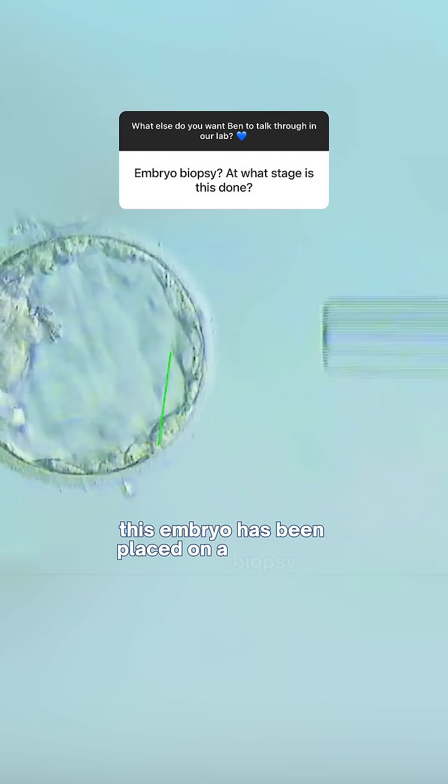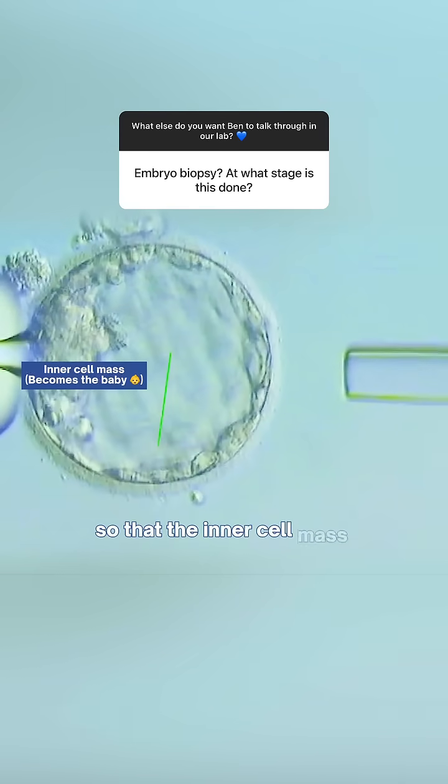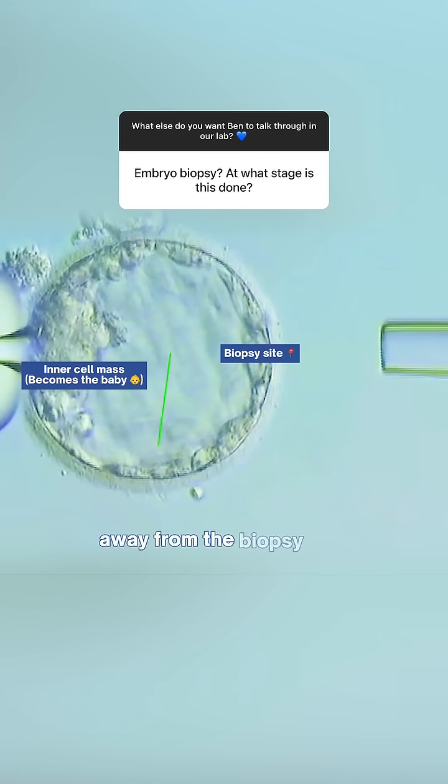As you can see, this embryo has been placed on a biopsy rig. It will be orientated so that the inner cell mass is at the farthest point away from the biopsy site.